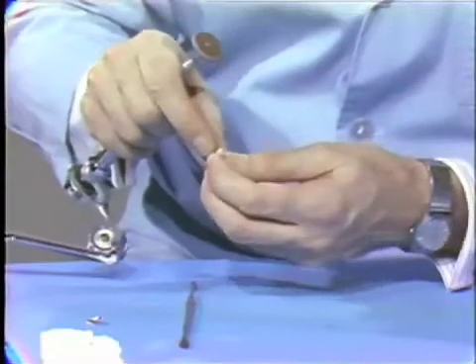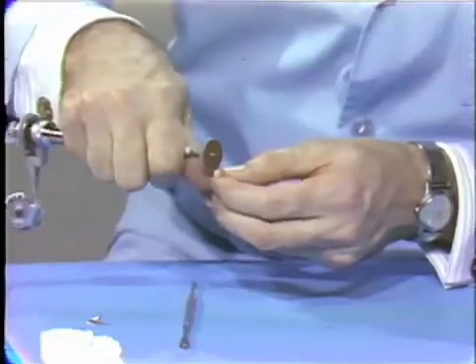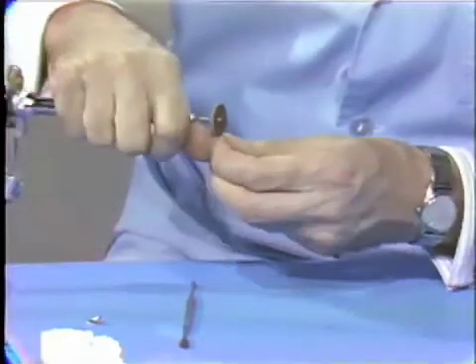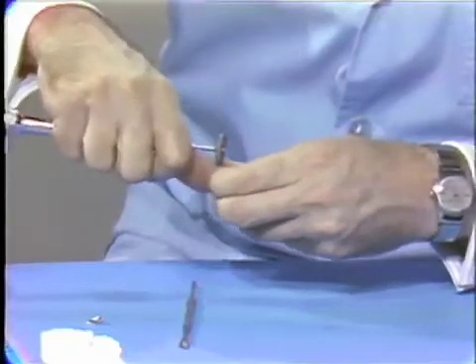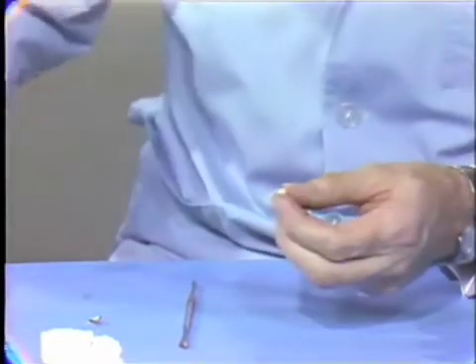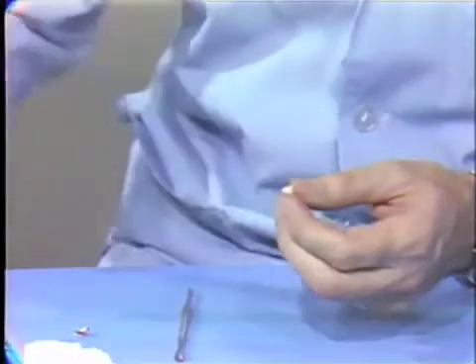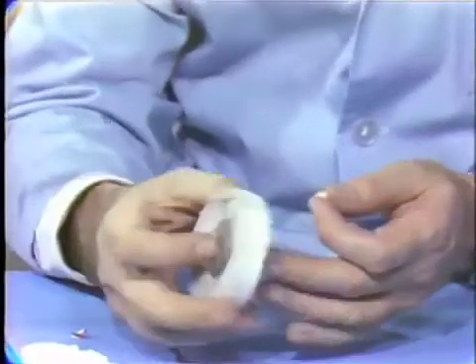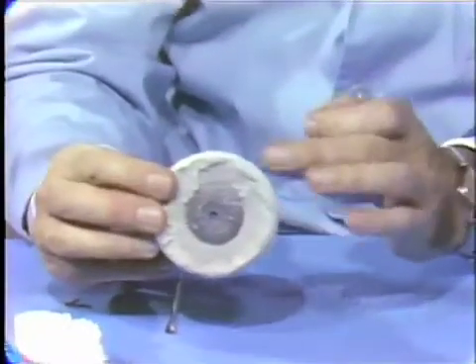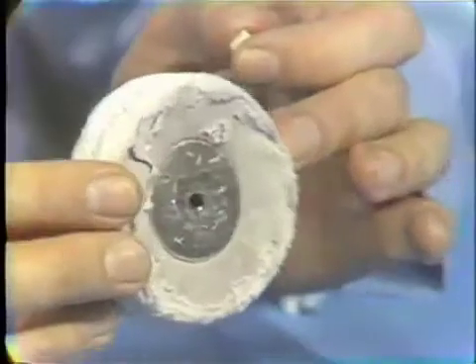You just dry it off from time to time and let the light shine on it. You get some idea as to the few remaining facets that may still exist, and you go over these again to eliminate them and smooth the surface down as much as possible. Now the next stages in polishing are to use silex on a Robinson bristle brush of this type in the handpiece, and then the final gloss and finish is put on with a cloth mop. A lead-centered cloth mop is usually used, using levigated alumina as the abrasive, which is applied in a paste form on here on the normal dental lathe.